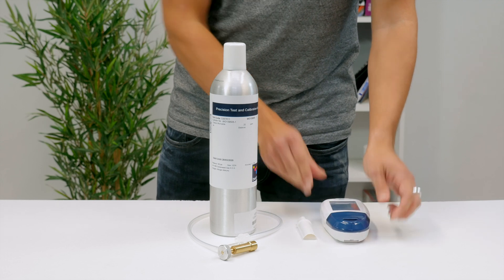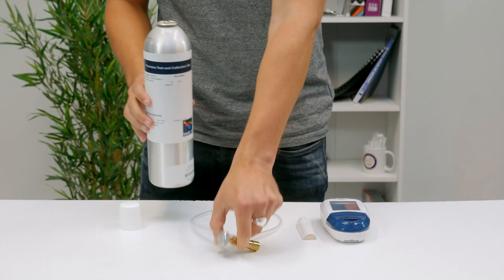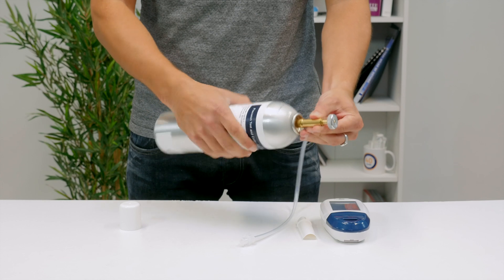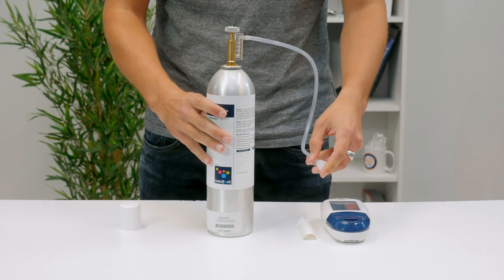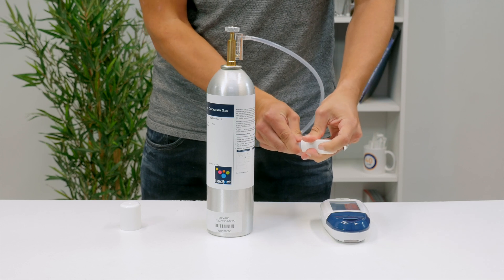You will need 20 ppm CO in air calibration gas to perform the check. Attach the gas canister to the regulator, being sure to screw the canister in securely. Then attach the other end of the regulator to the monitor.